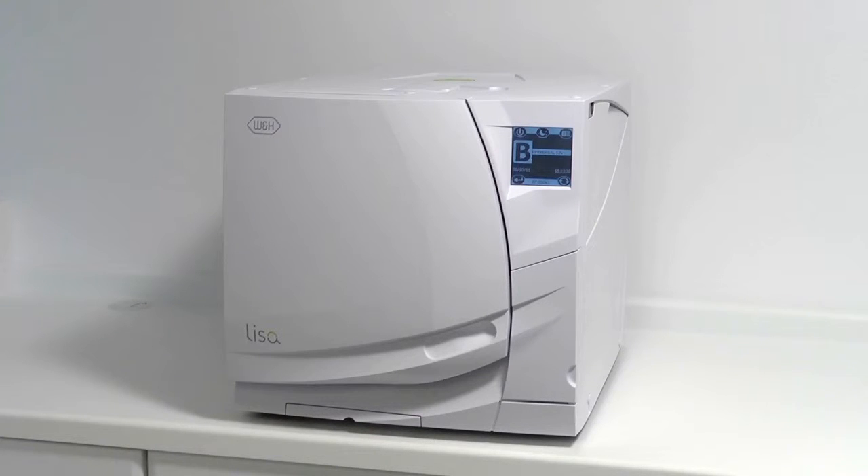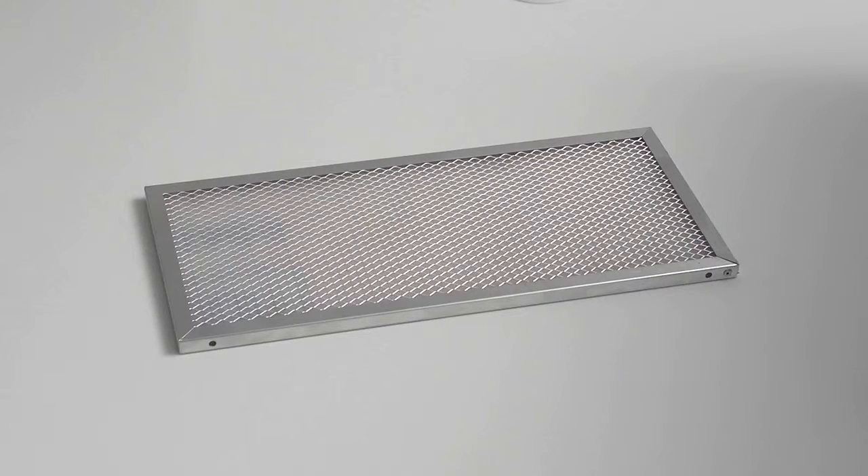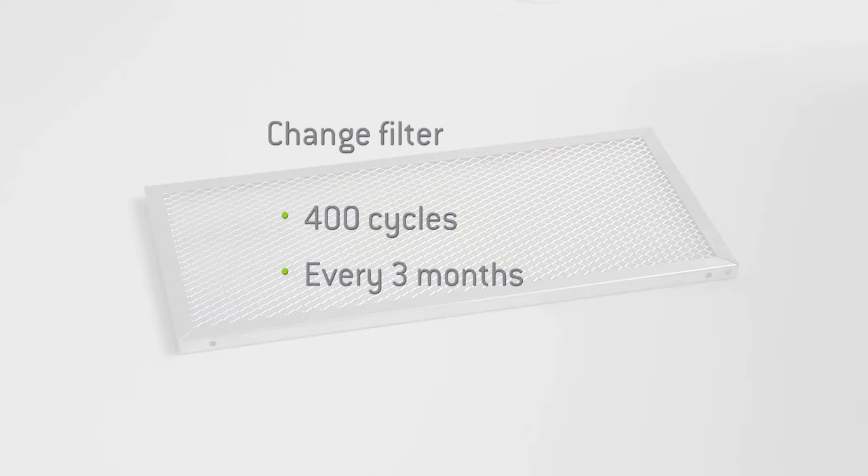Before proceeding to replace the filter, you must ensure your steriliser is not running a cycle. The dust filter should be changed at regular intervals of 400 cycles or every 3 months, whichever is sooner.